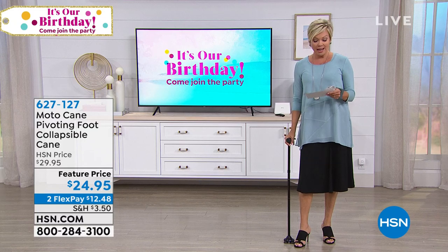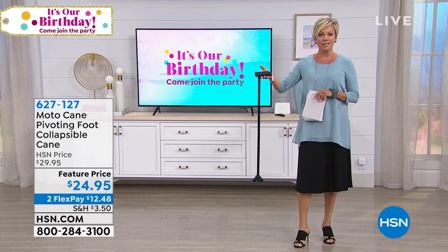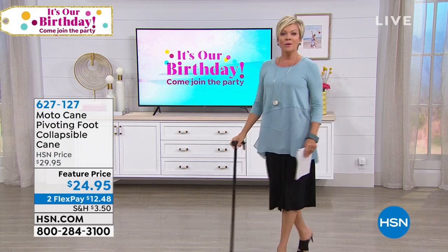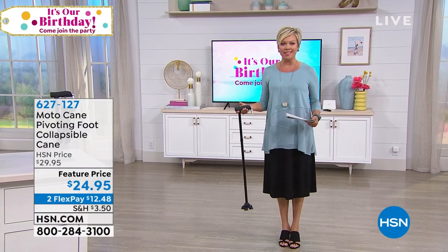So this is here at a featured price, by the way — $24.95, which is also on flex. And we're going to share with you how this collapses basically into nothing. You can put this in your purse and then pull it out after lunch and walk back to the car. It's nice to not have something too cumbersome to deal with.